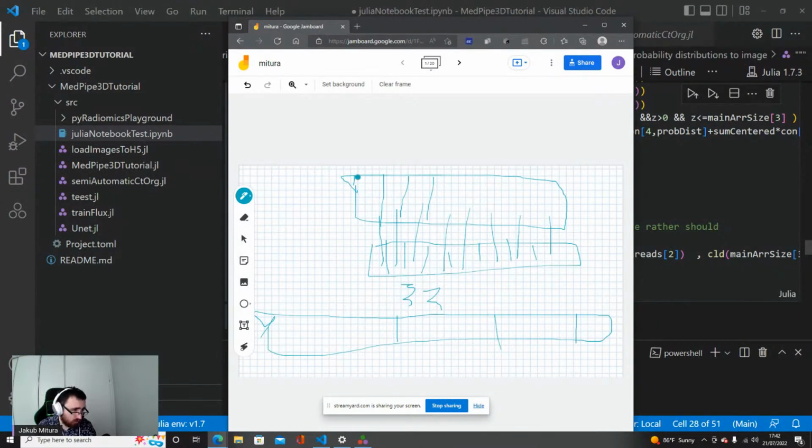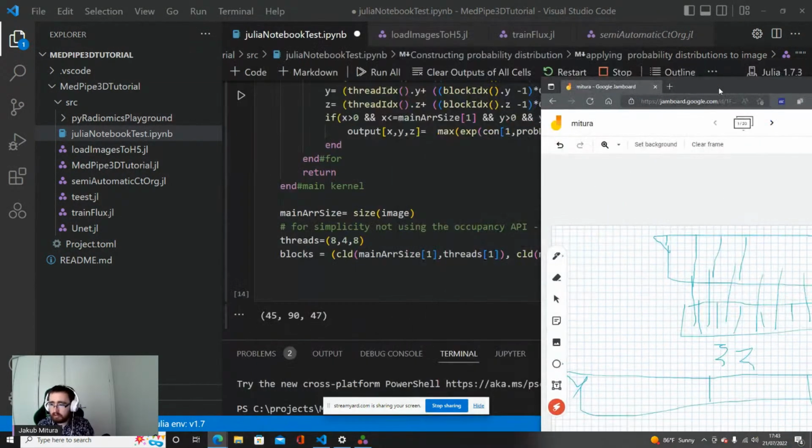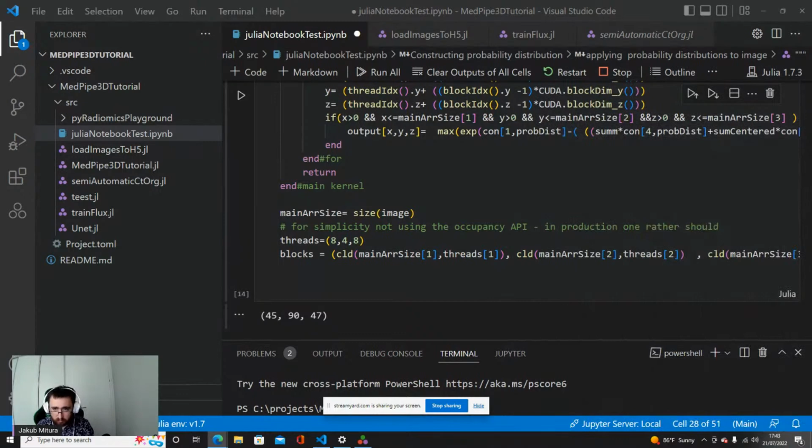So in order for the GPU to work the best, we need to get the data from spots that are nearby. Optimally, each warp, so each 32 threads, should have data that is next to each other, so 32 consecutive places in memory. This is very important from the optimization perspective.